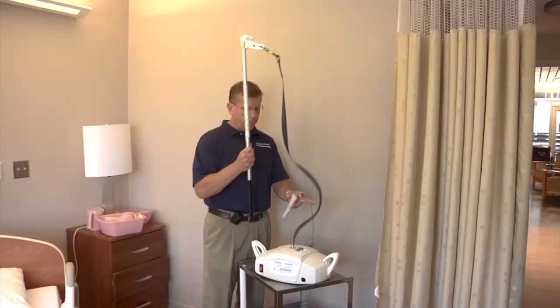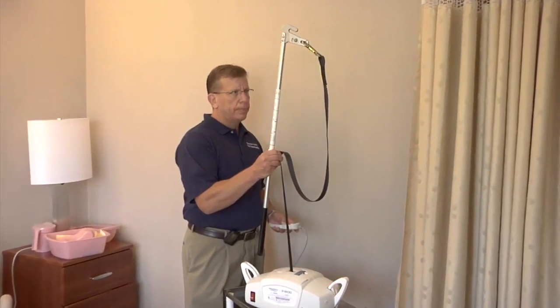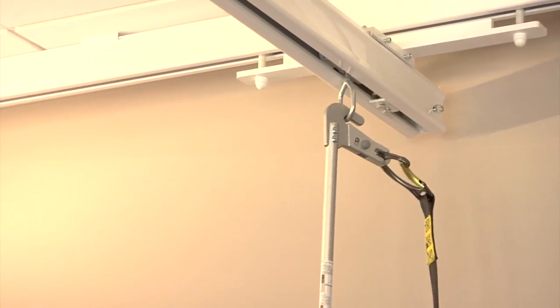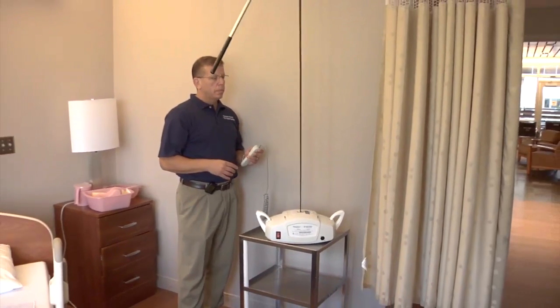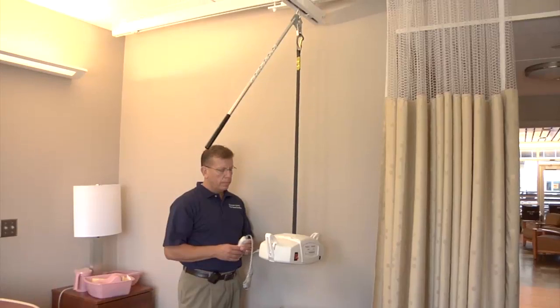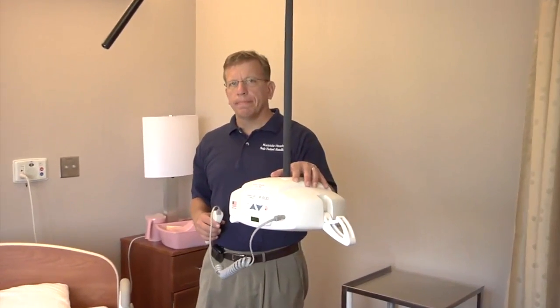Portable ceiling lift motors are easy to attach and use. Most important thing to remember is that when you're using a portable ceiling lift, you don't want to lift the motor. It's wheeled into the room on a cart. It is attached to a reacher bar. That reacher bar takes your strap from your portable motor and attaches it to the trolley up in the track. This healthcare worker is attaching the motor without any lifting or any exertion. By putting a little slack on the strap in the lowering position, it'll allow you to reach that trolley. With a push of a button, the motor is lifted off the cart, pushed over to the patient's bed, and it's ready to use.